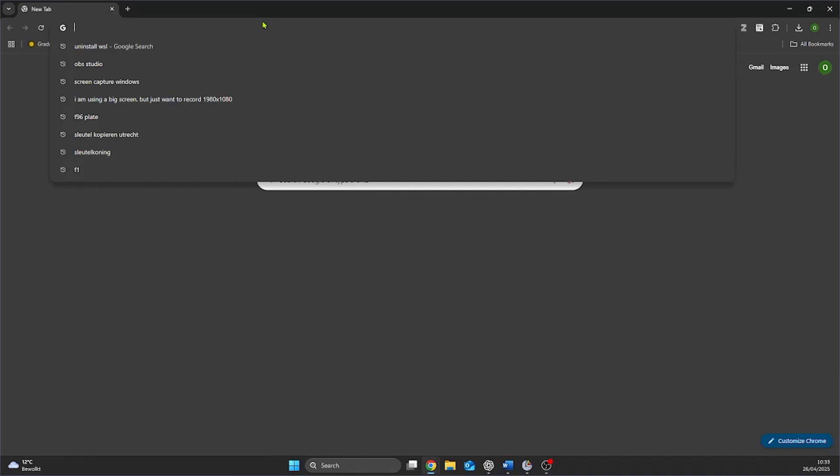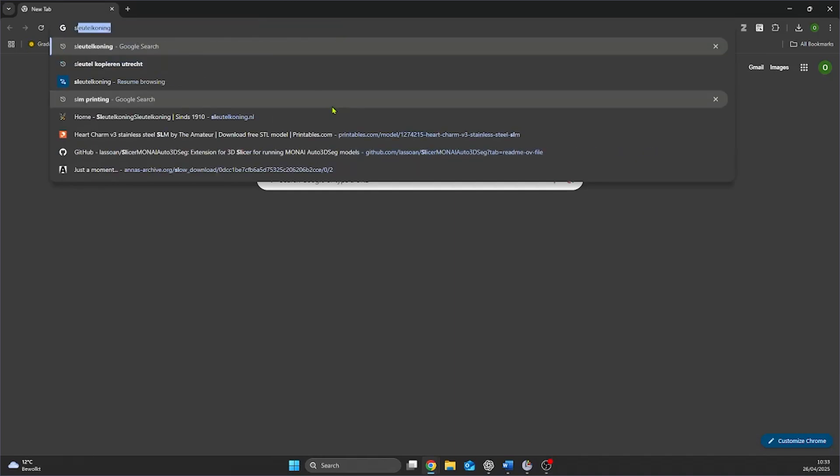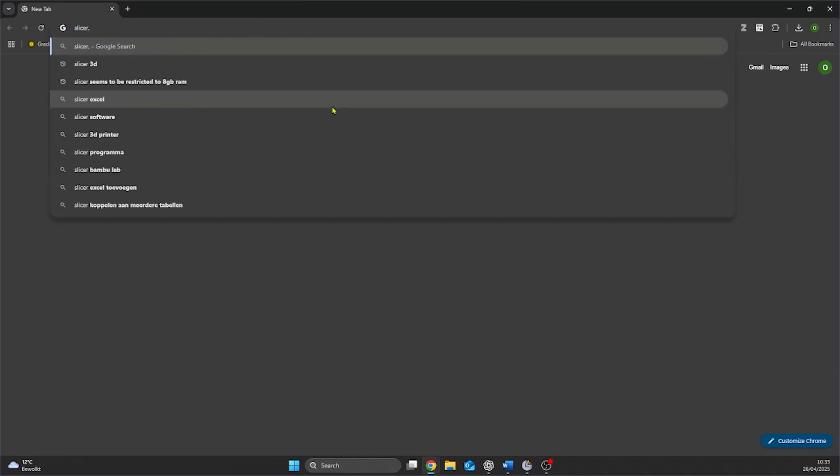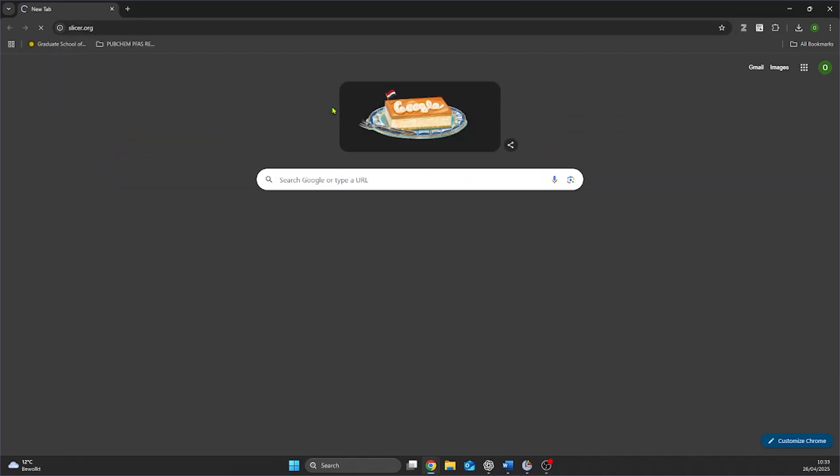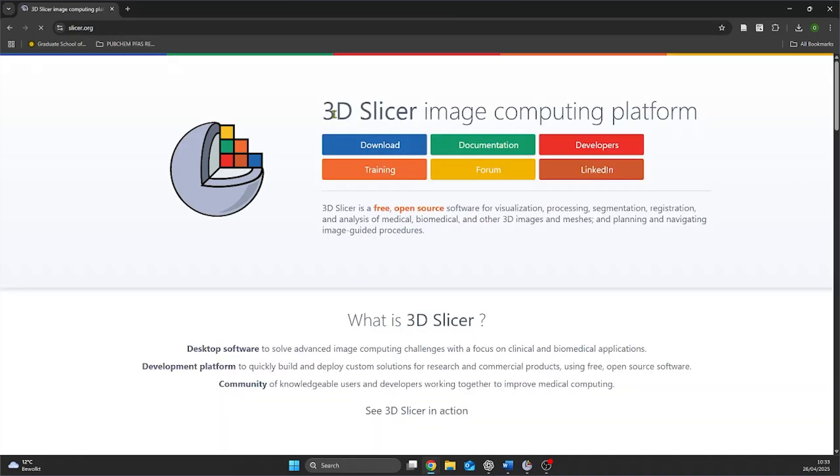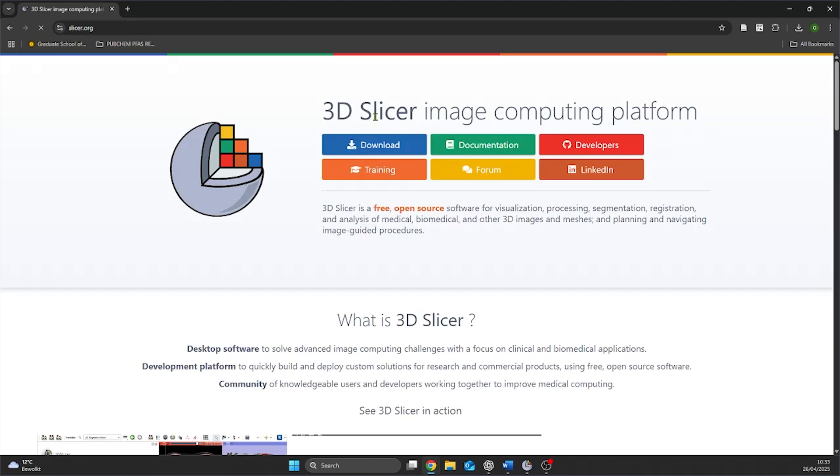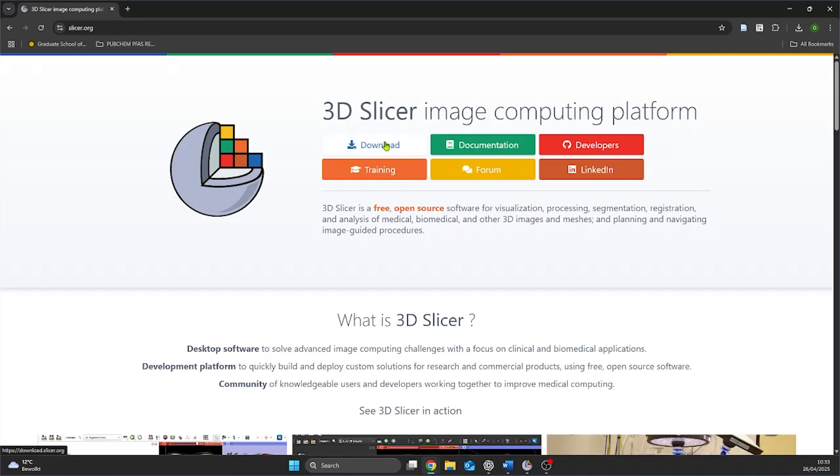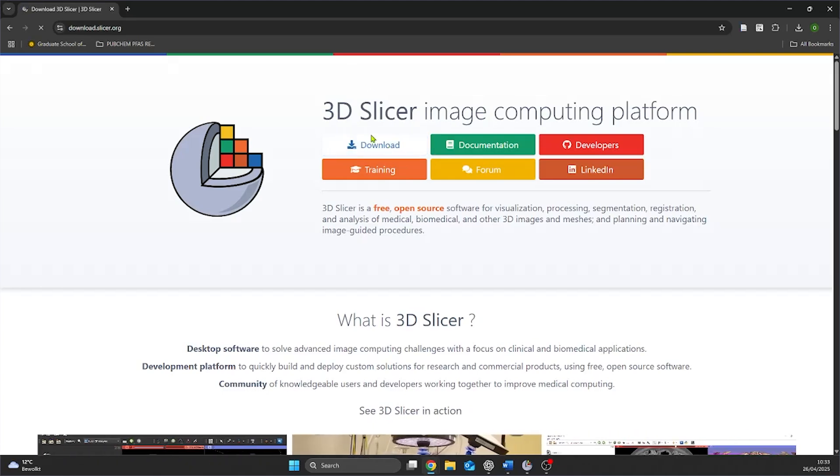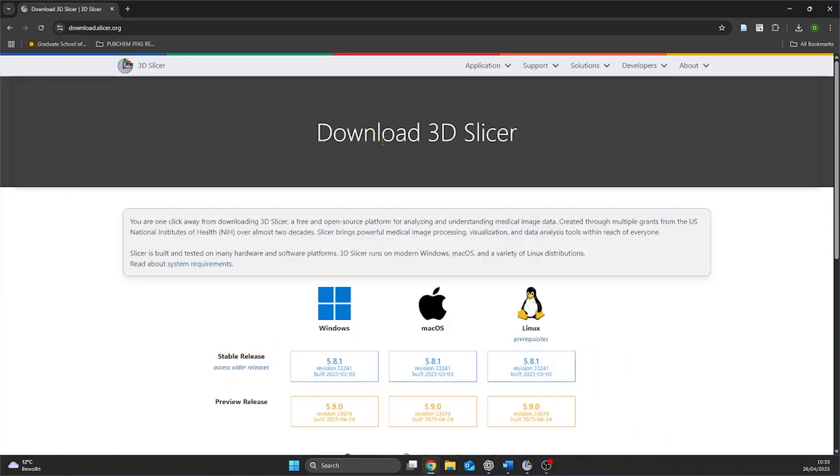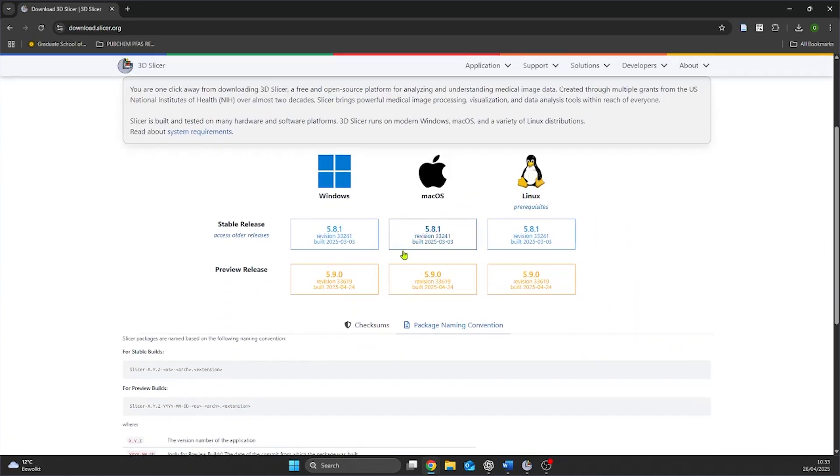We begin with installing Slicer3D from slicer.org. There are different versions available but we will download the version for Windows since that is what this tutorial is made for. After the file is downloaded we can install Slicer3D.